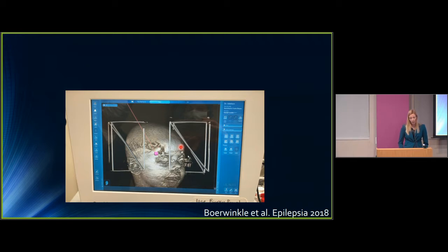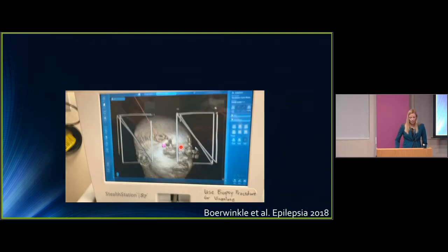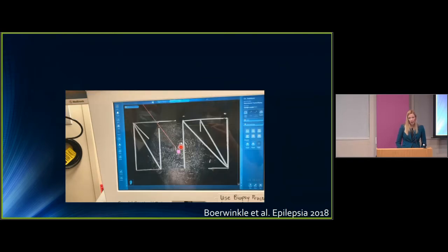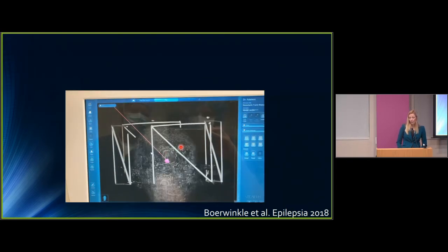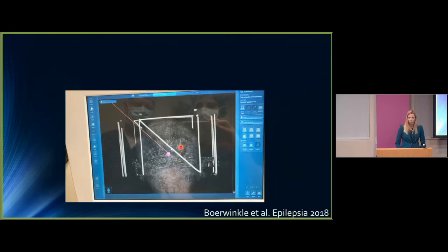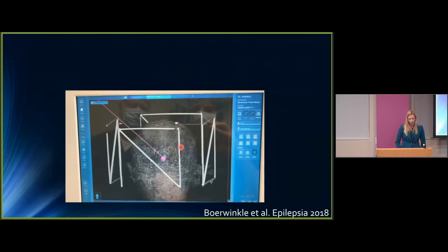And this is a child with a hypothalamic hamartoma, in which we found that we can use this test to help aim lasers into the brain and know where to disrupt the network in a child with a very deep source of seizure and cure that epilepsy. This is now pretty much a day surgery, and the child goes home the next day cured from their epilepsy.